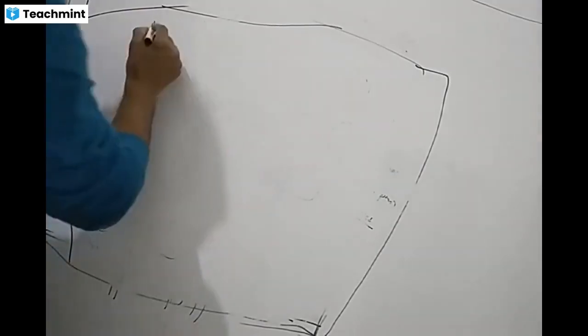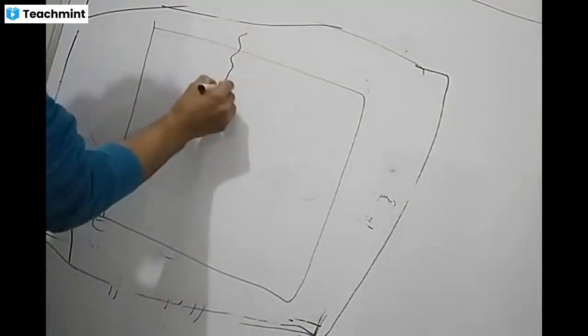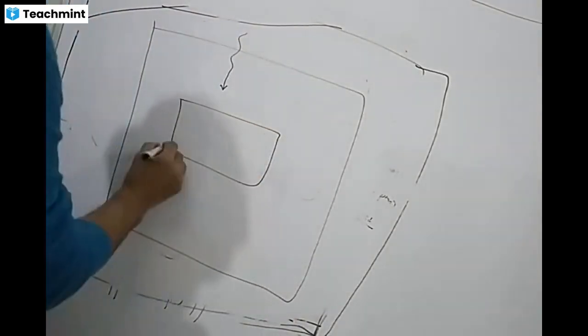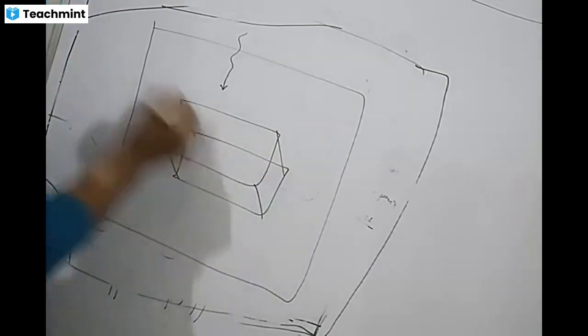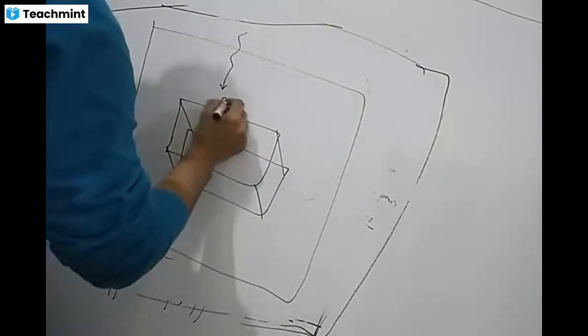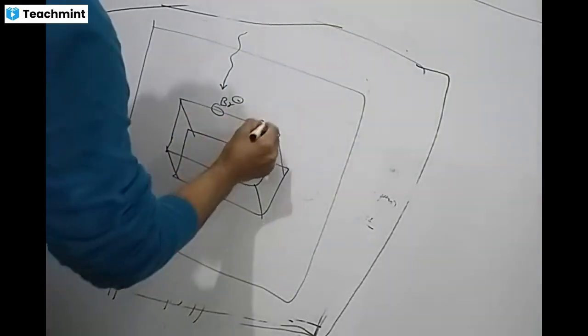So this is the emulsion, this is the photon, and this is our cubic crystal lattice. On the outer surface, which ions are there? Bromide ions are there, or some iodide also.